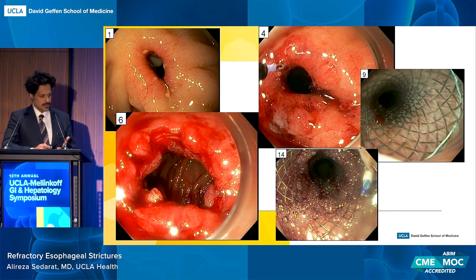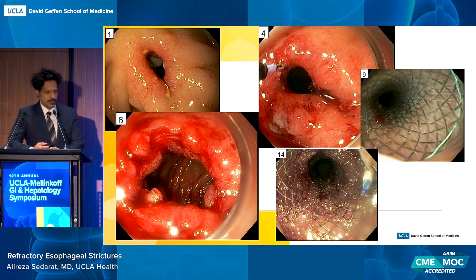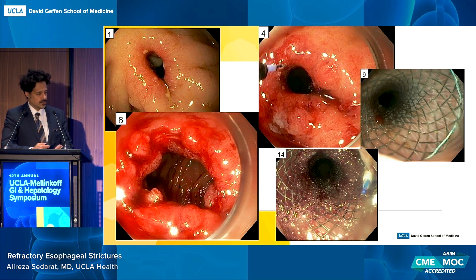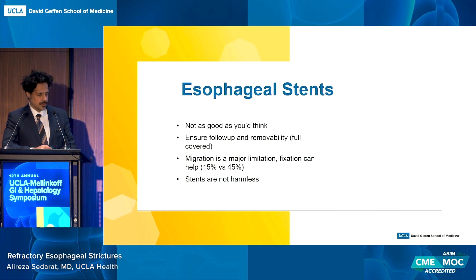This anastomotic stricture is in an ROUX-en-Y patient with a very small pouch, refractory to multiple dilation sessions, who was having dysphagia — functionally almost like an esophageal stricture. It's very easy: you kind of cut until just before a perforation happens, that's the key. Then put a stent in for a little belt-and-suspenders. The stent went in and he did really well.